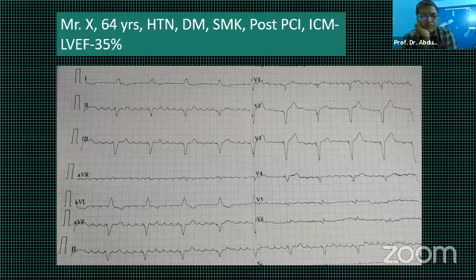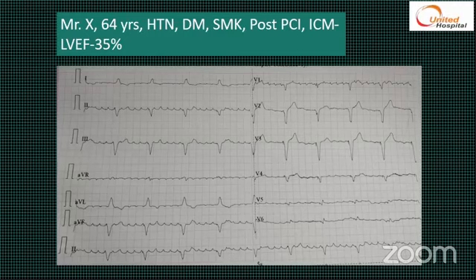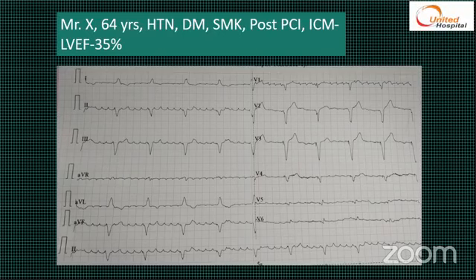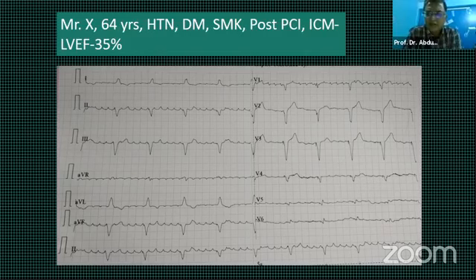All right. Now, why is it not atrial flutter? Likely, sir. So, what is the rate of atrial flutter? The rate is about 300, sir. Almost. Right, 300. Atrial flutter.